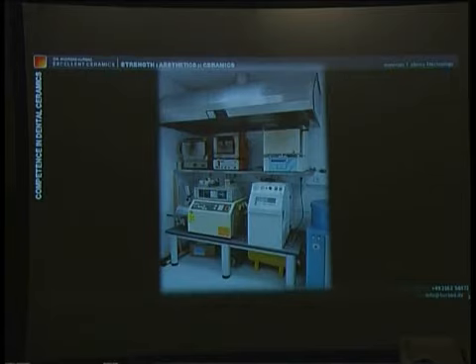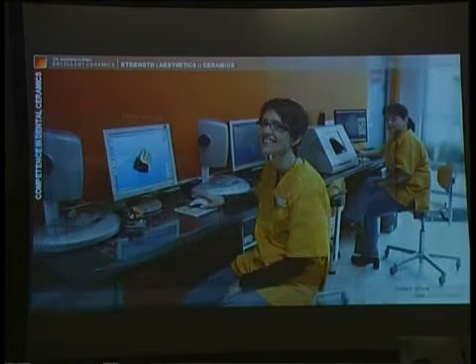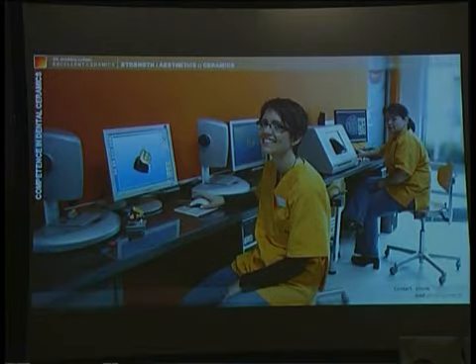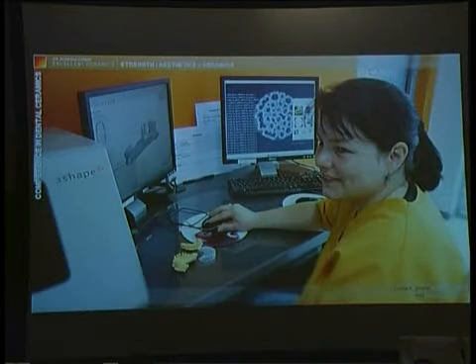This is the lab here, and if you have in your mind a picture of a dental lab, maybe it looks like this, but our lab is completely different. I can show you. This is a look in our lab, and you see we are working with different CAD/CAM technology. And if I would have seen such a picture like this 20 years before, I would think this is NASA control, ground control in Houston.